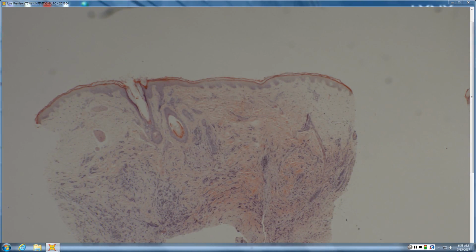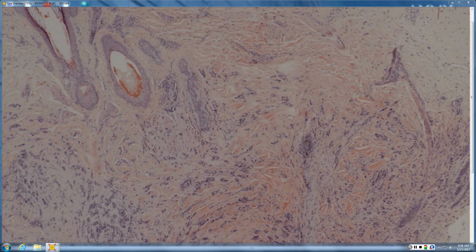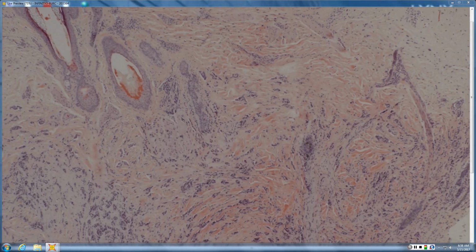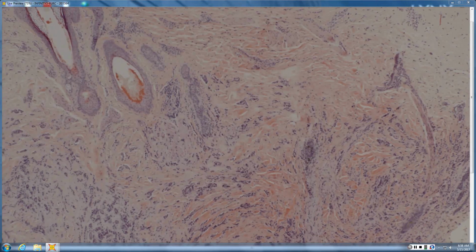This one was a scalp biopsy, I believe, and it says history: alopecia areata, no response to ILK. So, kind of a worst nightmare from a derm standpoint, but then you get the biopsy, and as you get closer in, you can see that these are definitely larger atypical cells. They're not just increased fibroblastic response or fibroblasts.